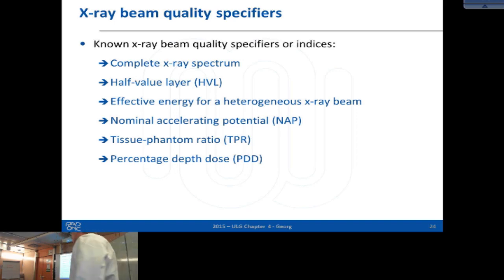And in kV units and kV therapy, we use half-value layers. Peter Homolka explained that already, so I can skip it. You know about the different energy ranges where aluminum and where copper is used? No, at least for our beams.